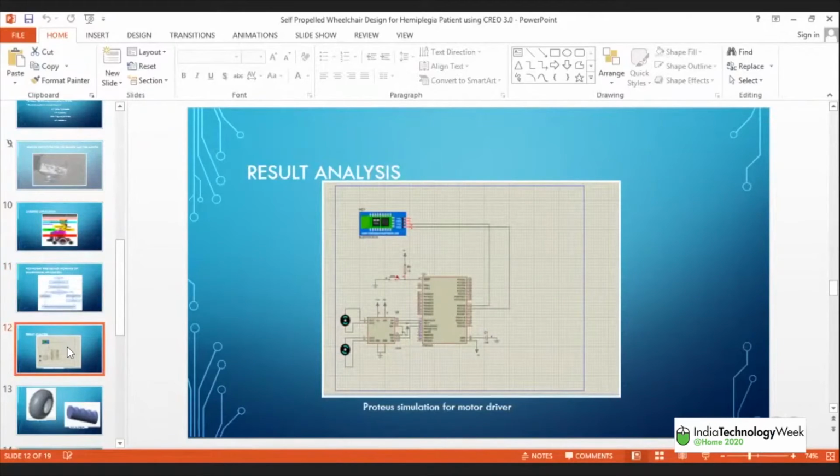This is a very good method to test the values of components that you have chosen, and it gives you an estimate whether your system, after networking, will work or not, right? So this is what we had done. We tested our system for the given set of microprocessors, pins, devices, and contact points, the buttons and all installed. So this is a screenshot of it.